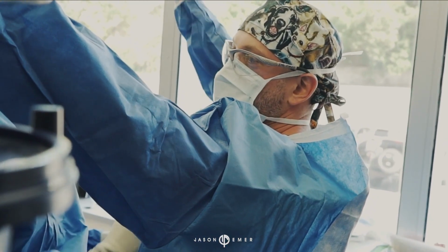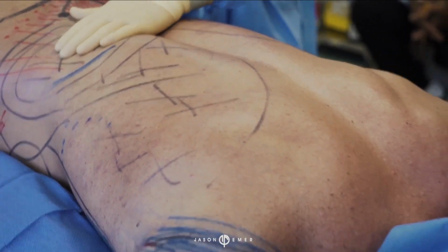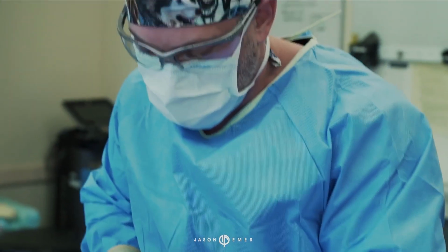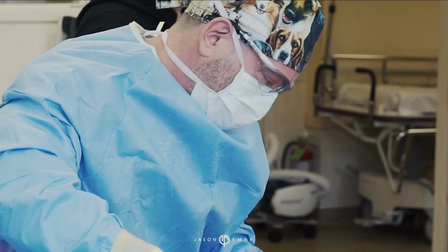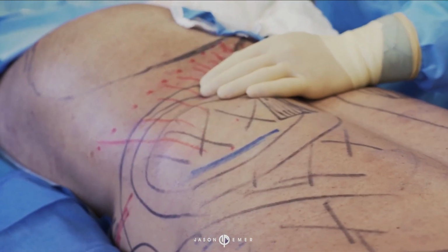So we're putting in the tumescent fluid right now, which is the area that's going to help us remove the fat. This is fluid that's going to fill the area, lift everything up so that we can remove the fat safely and use it for chest injection. On this side, we're going to do it on his shoulders because we're going to be working on his arms.